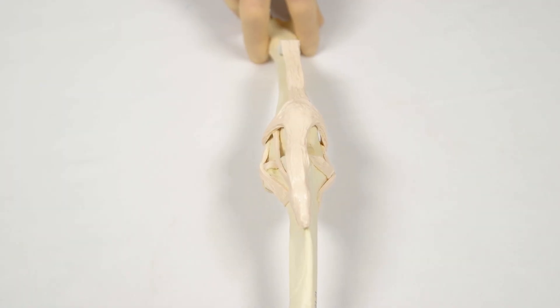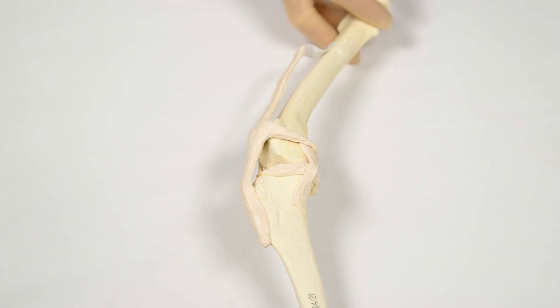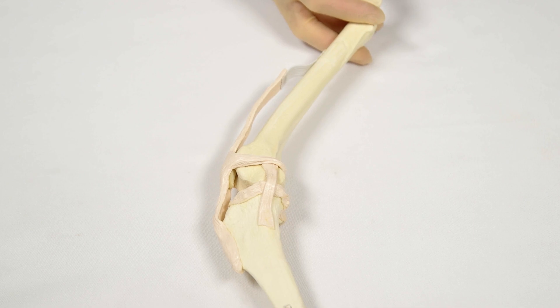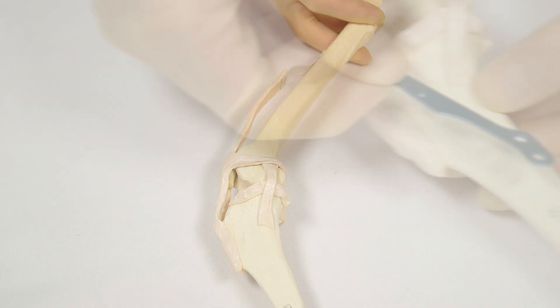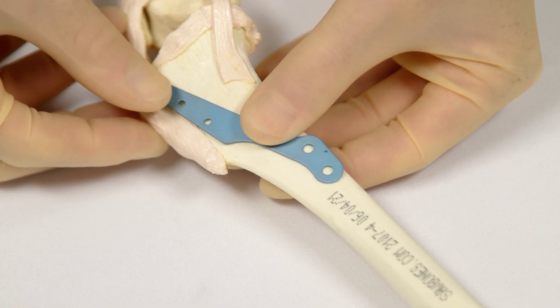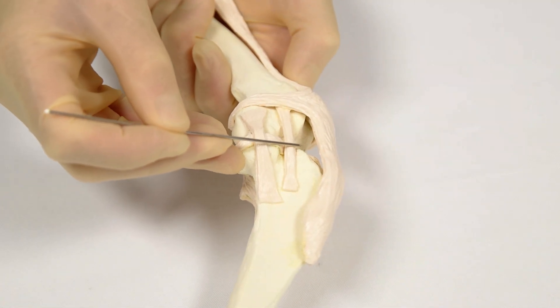The patient is returned to lateral recumbency with the affected limb downward, although experienced surgeons may be happy to complete the procedure with the patient in dorsal recumbency. The plate size chosen during preoperative planning is checked against the tibial tuberosity for fit. Identify GERDI's tubercle.